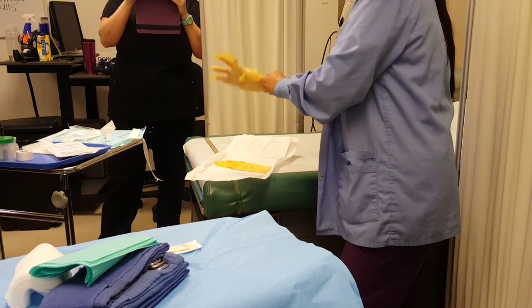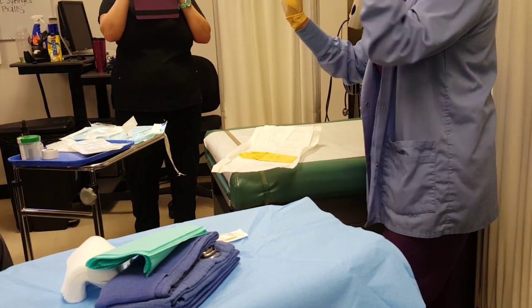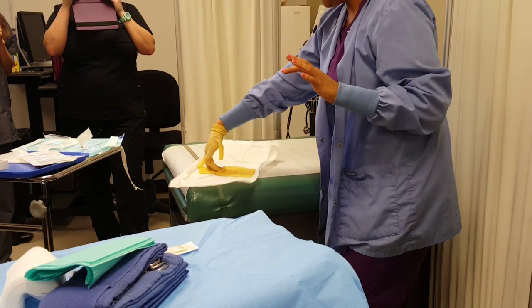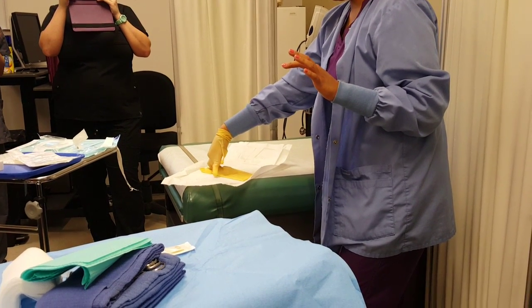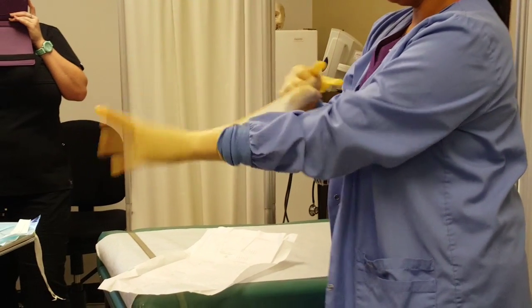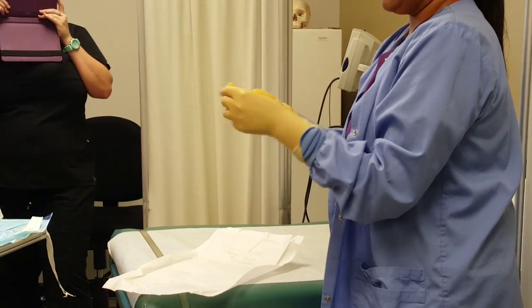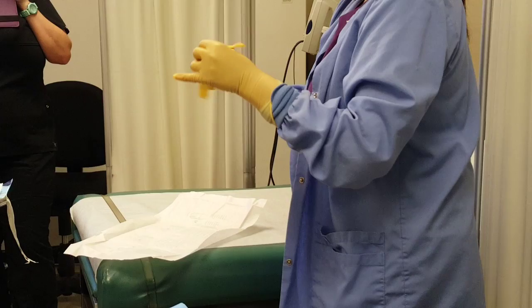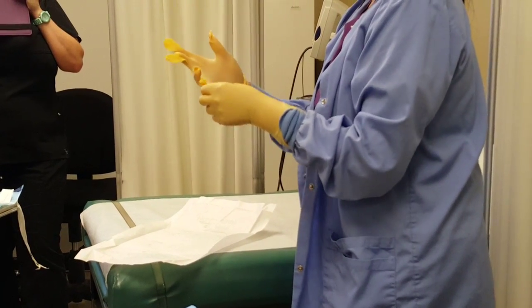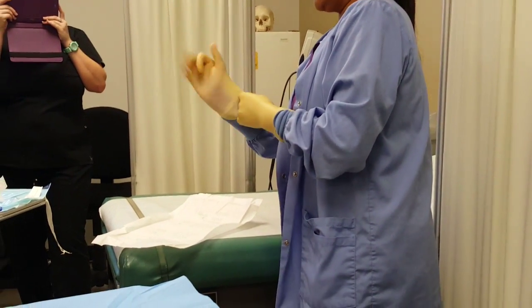Where your fingers lay, just let them lay — don't worry about adjusting them yet. You can't touch the fingers with your ungloved hand, so it's going to look a little awkward at first. Once the first glove is on, you can use that gloved hand to touch the outside of the second glove and put it on. Then you can go back and fix the fingers on both gloves.